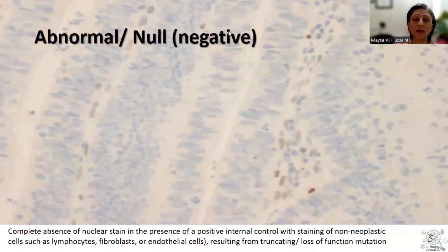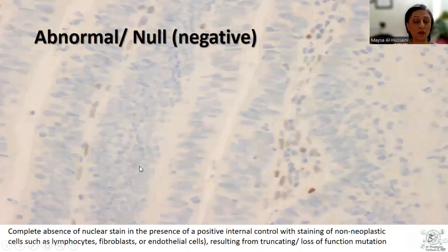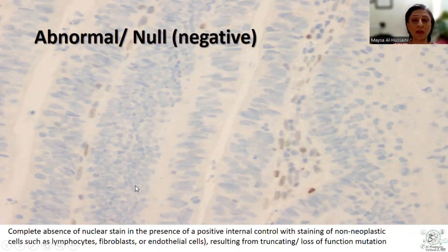The second pattern, relatively recently described, is the null pattern, or negative pattern, in which we see complete absence of staining in the nuclei of the tumor or lesion, in the presence of a positive internal control — some lymphocytes, fibroblasts, sometimes endothelial cells. This is the second most common pattern of abnormal P53 staining, termed the null pattern, and is associated with a different type of mutation, yet is considered to be mutant.